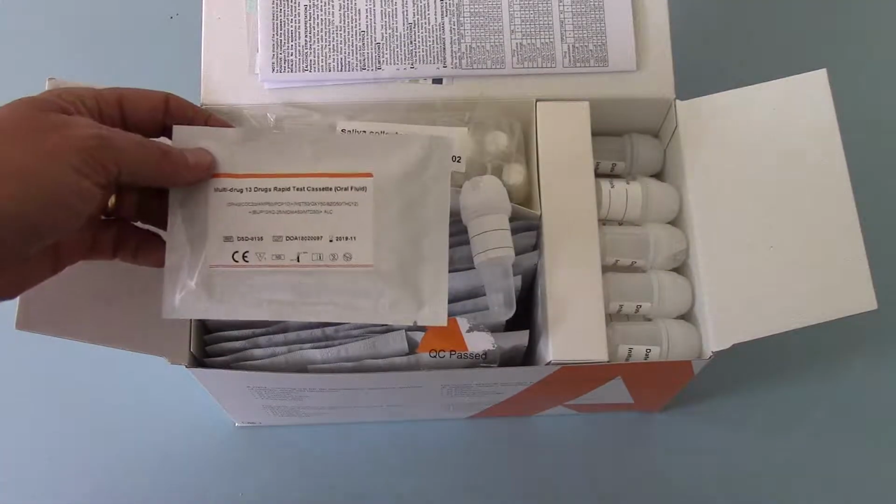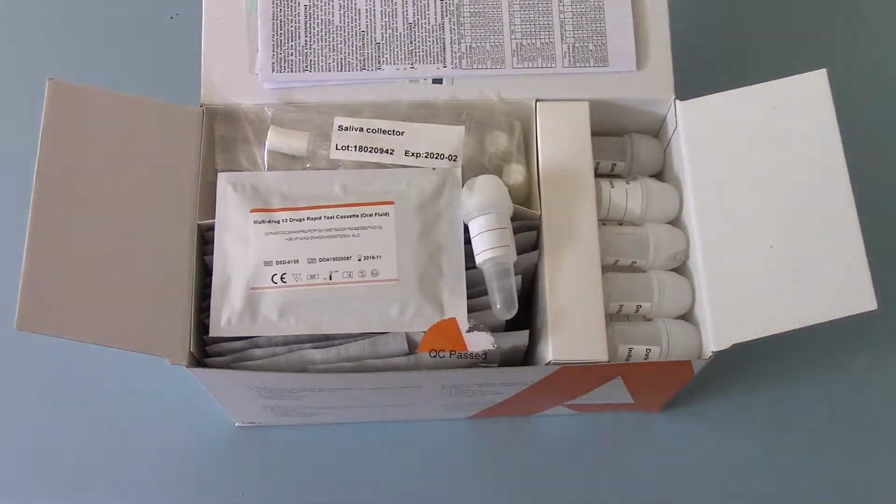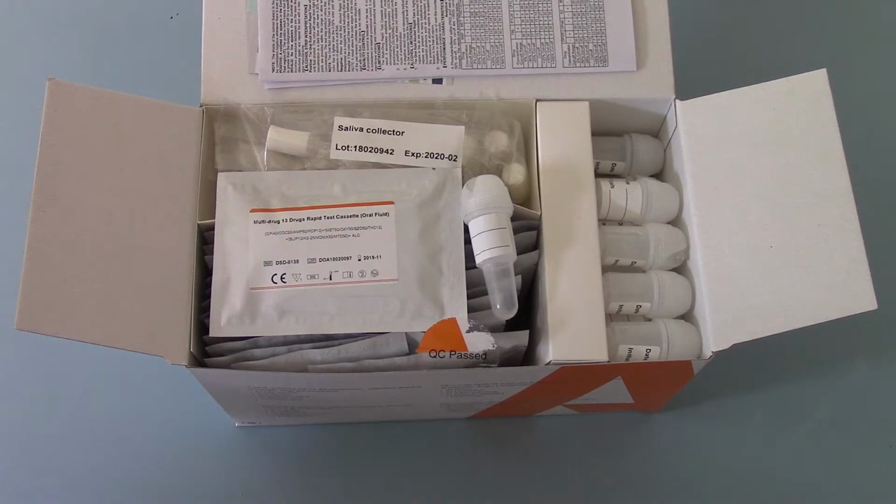Okay, so in part 2 what we're going to show you is that kit stripped down and open, ready for testing. And we'll show you the collection of saliva, how to process that through the bulb and into the test panel to run the tests.